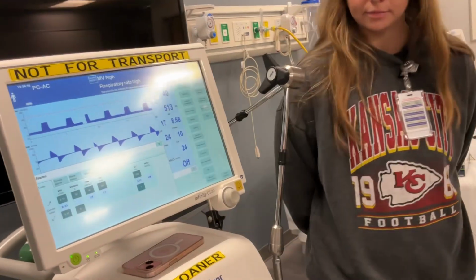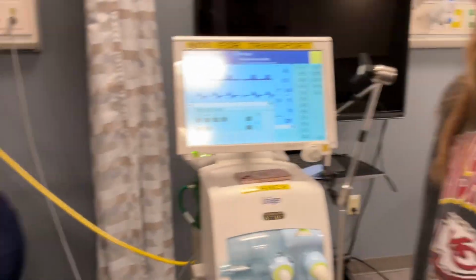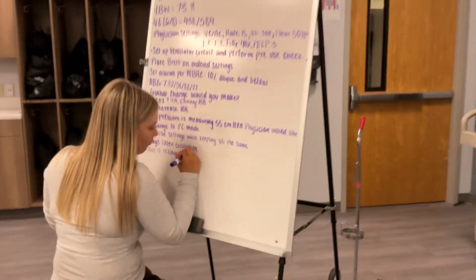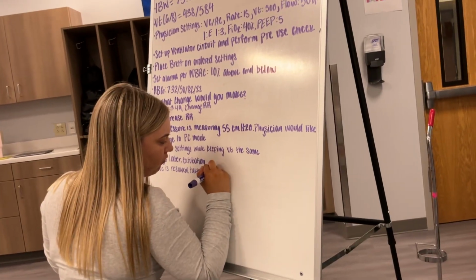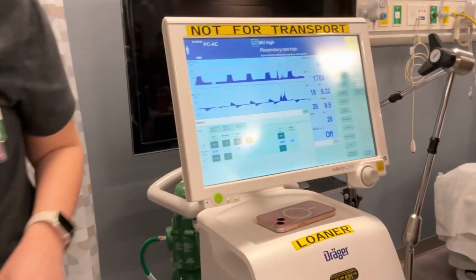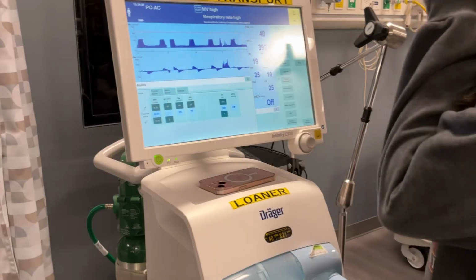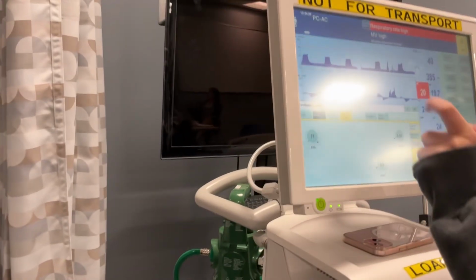All right, you guys. Now I think I'm gonna have to switch this over to my lung, because I don't know if it will breathe for it, but we'll find out. Okay, guys. So now go ahead and switch Brett over to 5/5. Wait, what am I doing? Switching Brett over to 5/5.